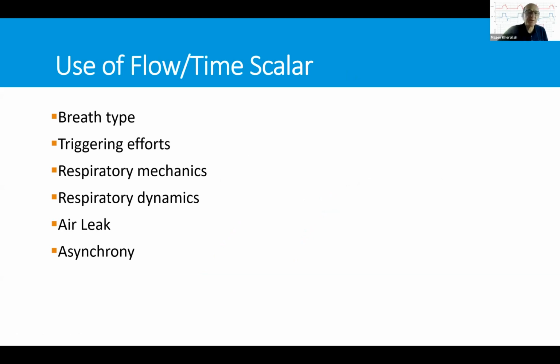We're going to go through breath types and then triggering efforts, respiratory mechanics, respiratory dynamics, air leak, and asynchrony.